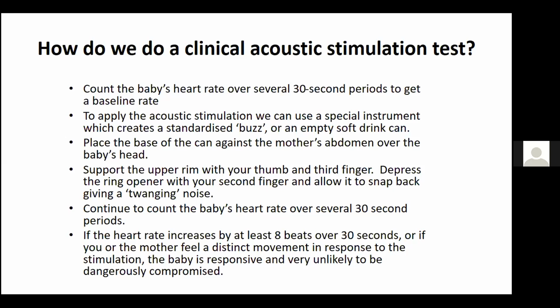As you continue the trace, you need to do what is called an acoustic stimulation. So basically, when you do an acoustic stimulation, you really need to use an instrument, right? You want to create a loud sound, which is going to transduce through the liquor, go to the fetus and cause an acceleration.